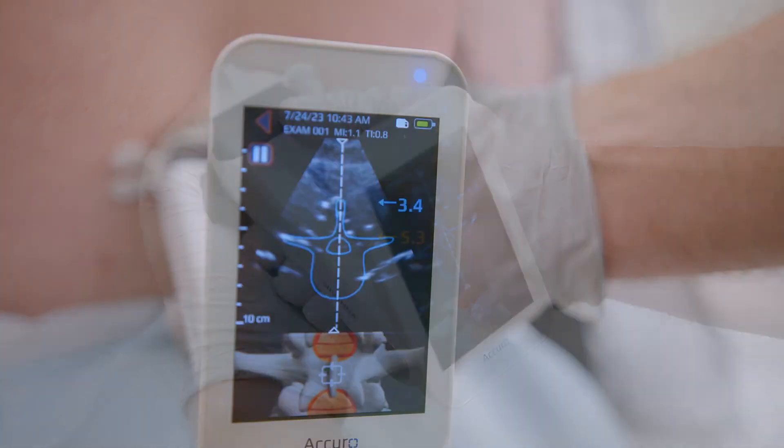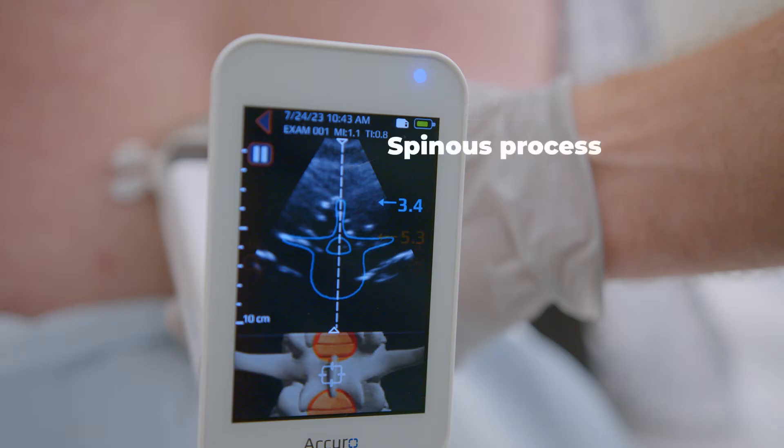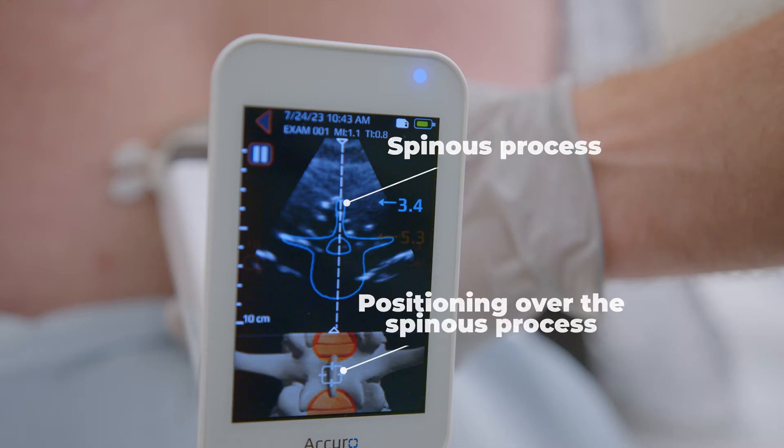Identify midline, indicated when the vertical dashed line runs between the two triangles at the top and bottom of the ultrasound image. Notice the blue overlay, which represents the spinous process.